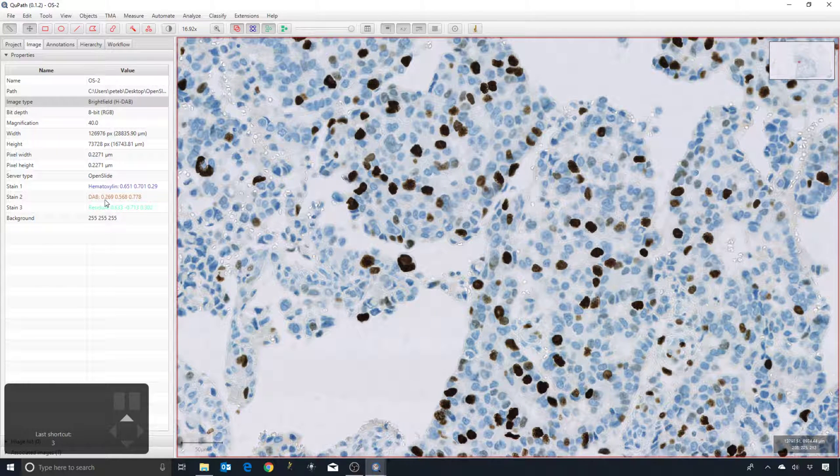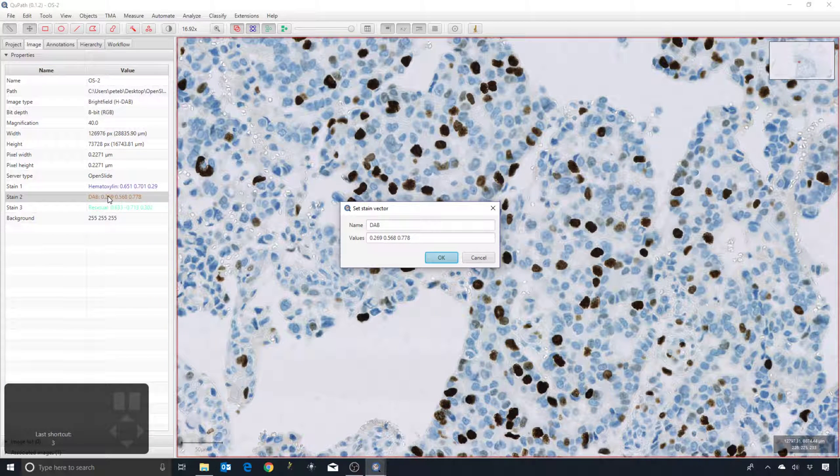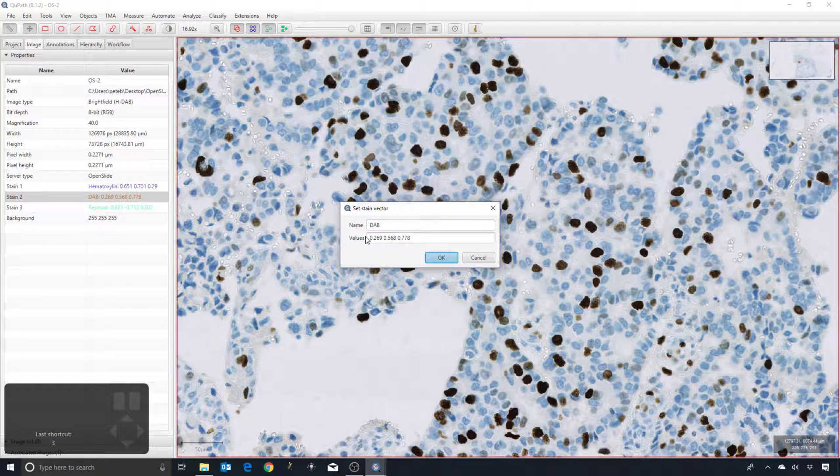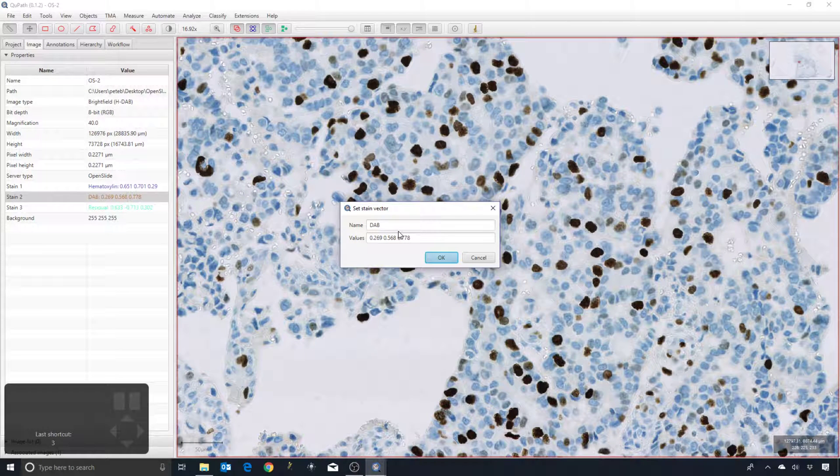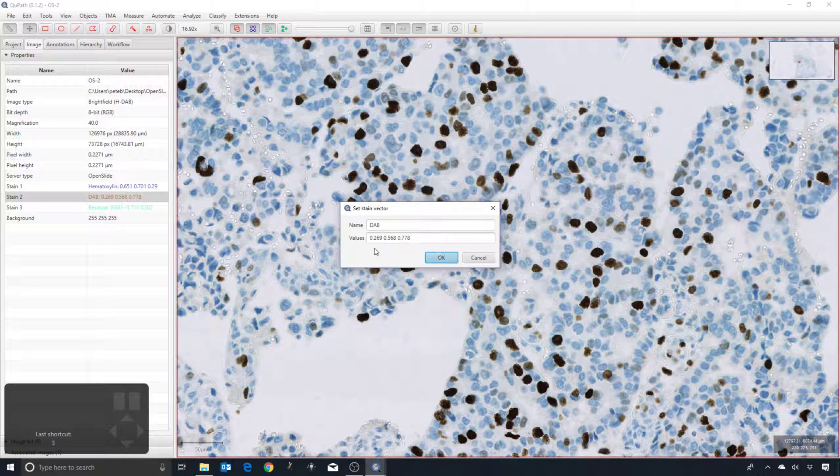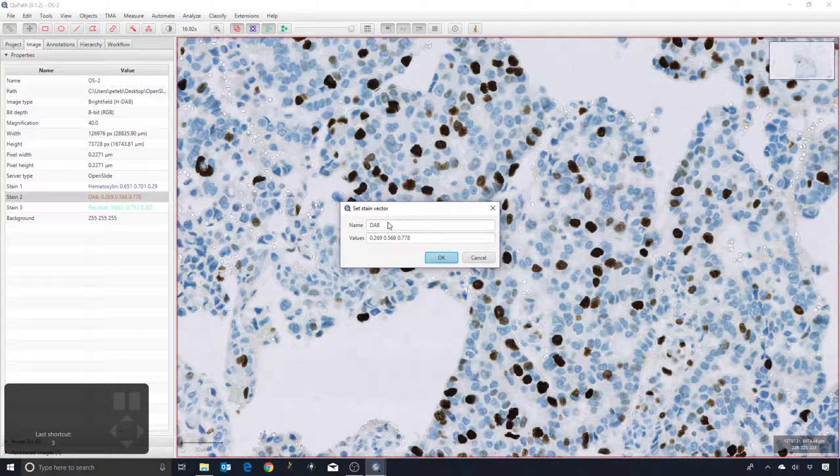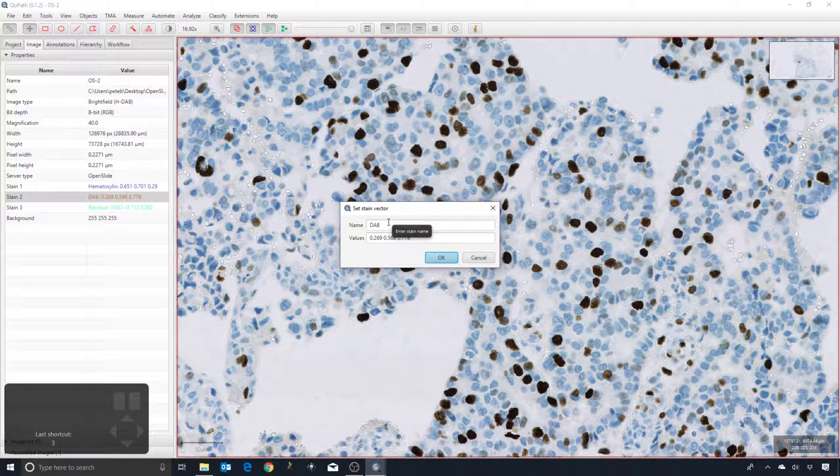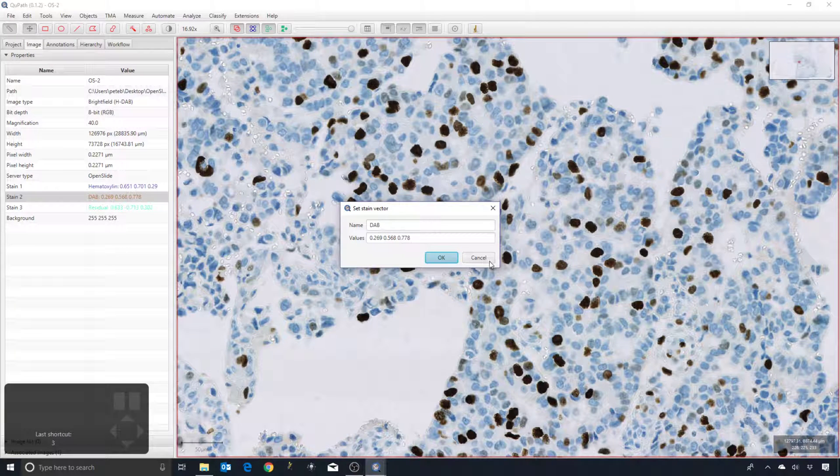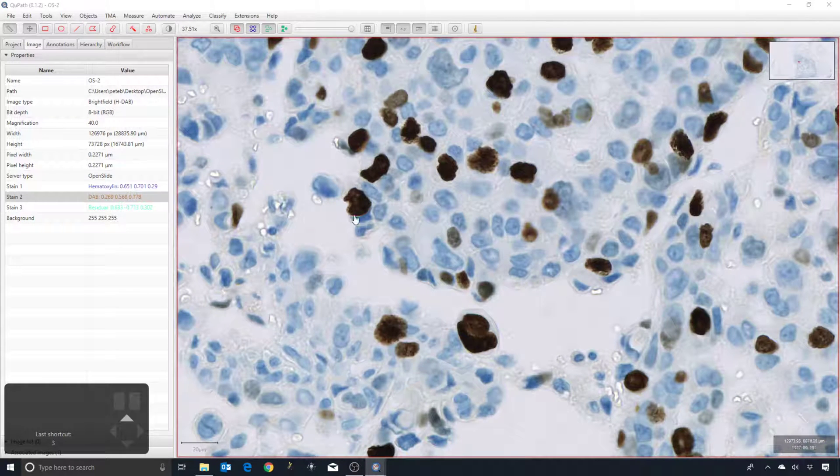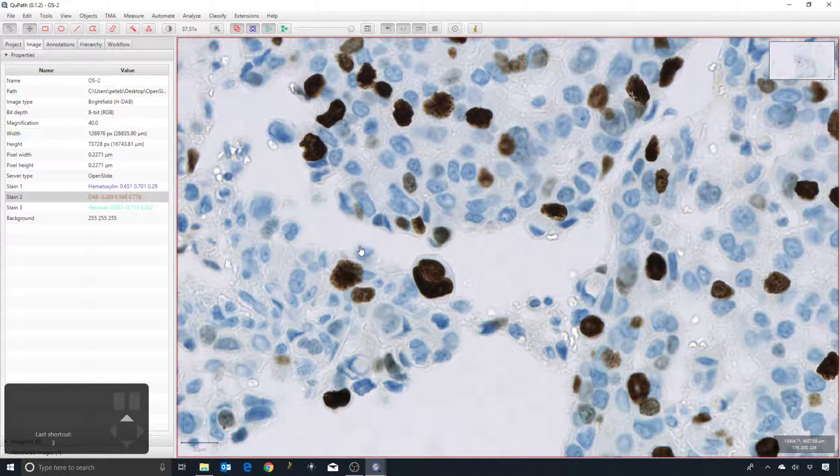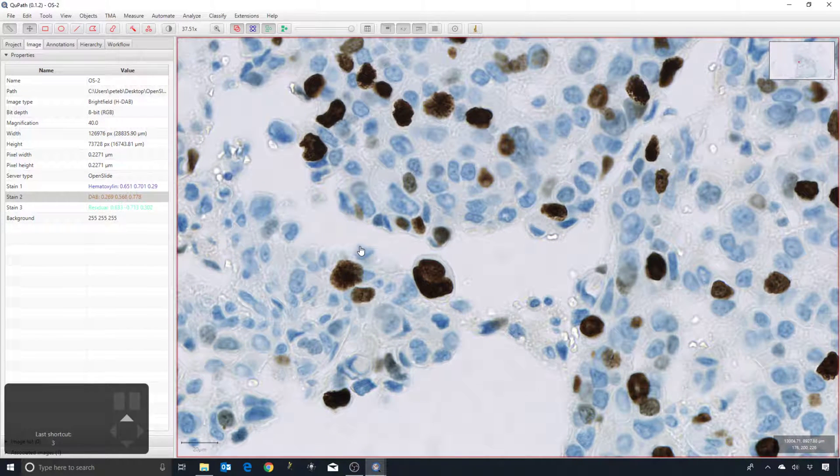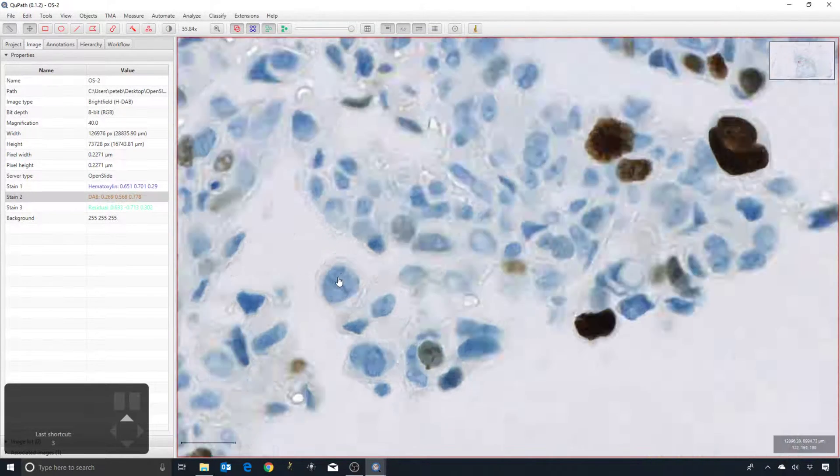What we can do if we want is we can improve these estimates. One way is we can simply double-click on one of the values and then we can enter in and use the stain vector. If you know about color deconvolution and stain vectors, then you may have some characteristic values that you want to use. They can be entered here in the order of red, green, and blue. You can also change the stain name if you particularly need to, although some of the commands within QuPath are specifically for H&DAB images, in which case you probably don't want to change them.